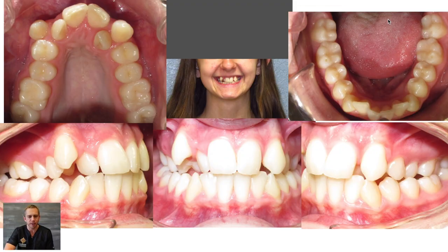Let's jump in and show you this patient. This patient had a crossbite — both an anterior crossbite, which is a crossbite with the front teeth. You can see this tooth here is stuck behind the front ones. She also had a posterior crossbite, meaning the back teeth were in crossbite. You can see her upper arch is too narrow compared to the lower arch. In this video, we're going to show you how we fixed both her anterior and posterior crossbite.